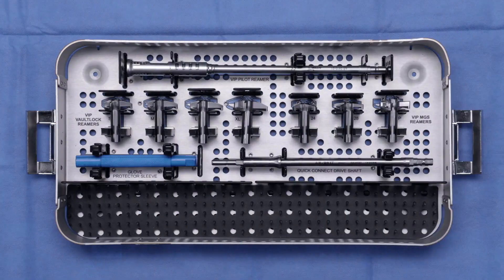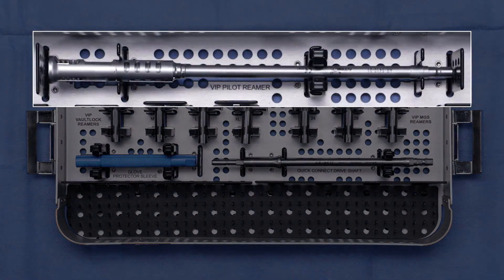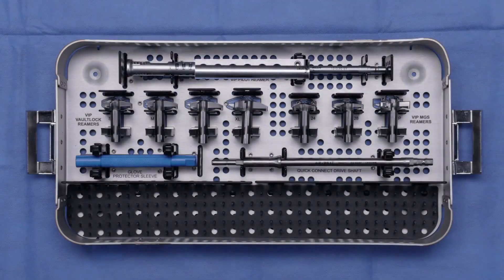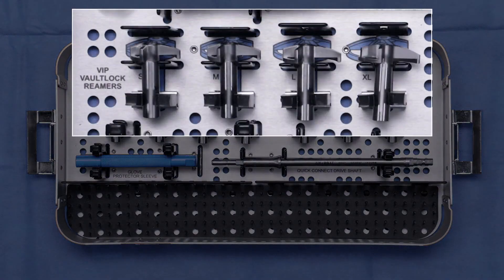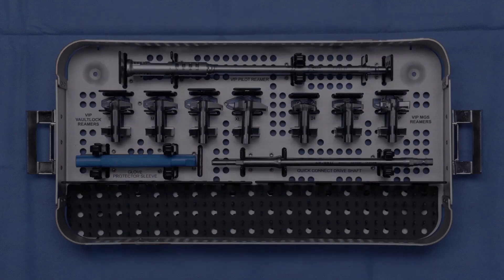Next, I wanted to introduce you to the VIP glenoid reamer tray. It's a pretty simple tray. First, we have our VIP pilot glenoid reamer. Next, we have the secondary reamers — secondary reamers for the vault lock and also for MGS — and the standard reaming equipment from the other trays that you're used to.